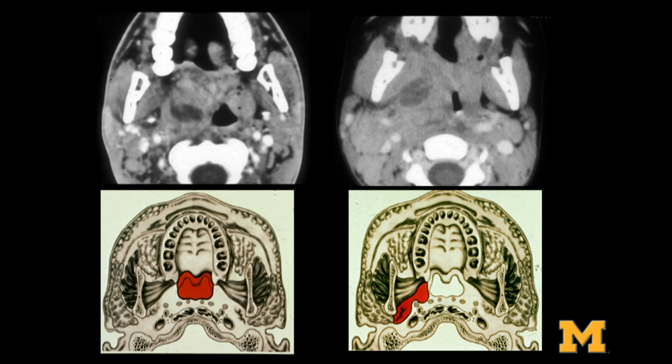So now the issue is what would you call this disease entity? Let's just say it's an abscess, and it is an abscess. So what would you call this disease entity? How many would say it's a peritonsillar abscess, right? Okay, peritonsillar abscess is what we default to, but in actuality, this is an abscess involving the tonsil, and this is an abscess involving a space. Now, what space is this triangular space here that's next to the pharynx? What do you call the space next to the pharynx? That's the parapharyngeal space. So on your left, this is a patient that has a tonsillar abscess, and on your right, it's a patient that has a parapharyngeal space abscess.